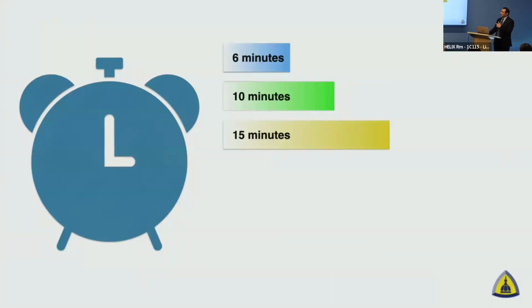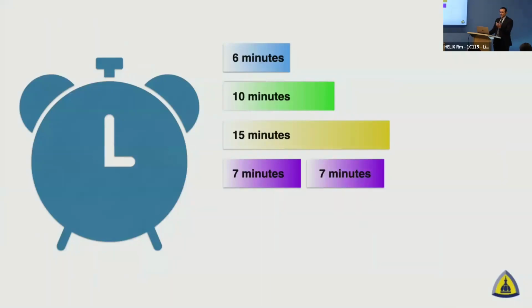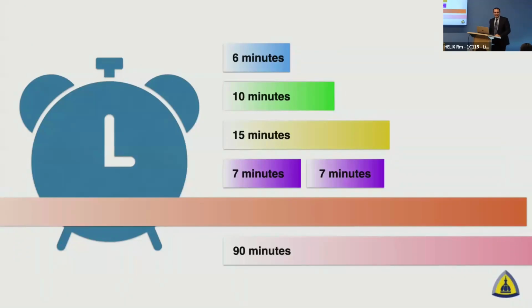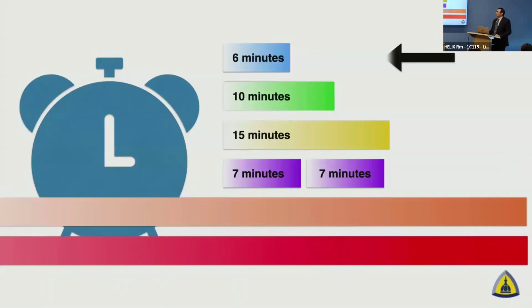Some other people recommend doing 15 minutes, but that's kind of long for one scan, so they split it up, 7 minutes and 7 minutes, and combine those two. Some people say 30 minutes is necessary to make sure you have stable network depictions, and we'll talk about this in a little bit. Other people said you have to do 90 minutes, Jeff Anderson, which nobody is going to stay in the scanner for. I mean, put your chairs down. So you have to be practical. We did 6 minutes before, now we do 10 minutes.